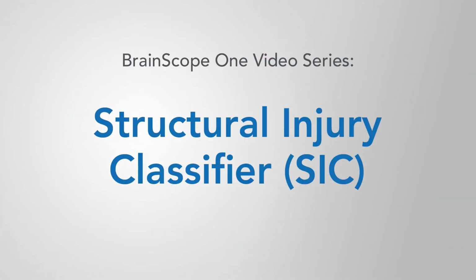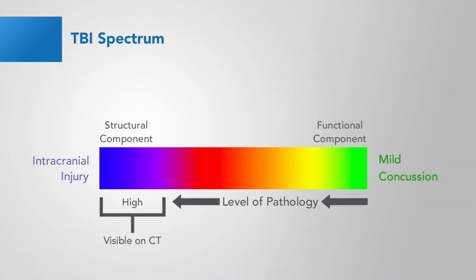This video focuses on the structural injury classifier. Traumatic brain injury is complex and heterogeneous and includes many different etiologies. One way to think about TBI pathology is as a spectrum. All the way to the left, we have intracranial injury or bleeds, and all the way to the right, we have mild concussion or functional injuries.